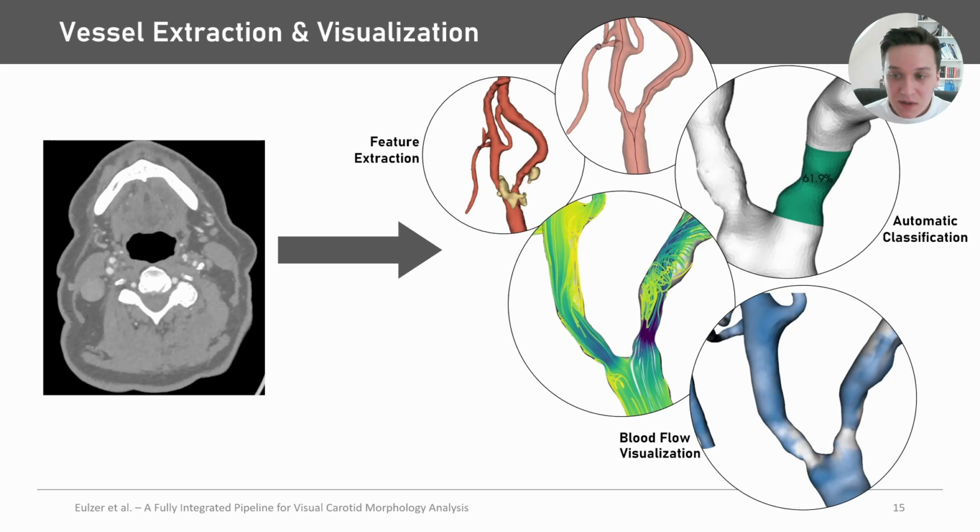First, because complicated processing is necessary for feature extraction, classification, visualization. And second, we also have kind of the reverse problem. The accuracy of the geometric models somehow needs to be validatable. So to actually apply advanced vessel visualization in a clinical context, we need a very stable and sound system that fulfills not only a good data viz, but also an efficient workflow for data extraction and data validation.